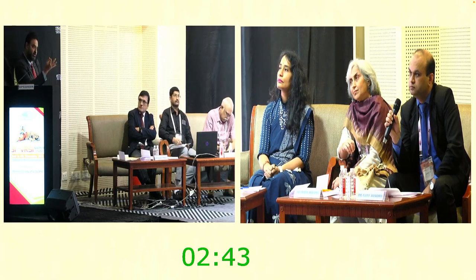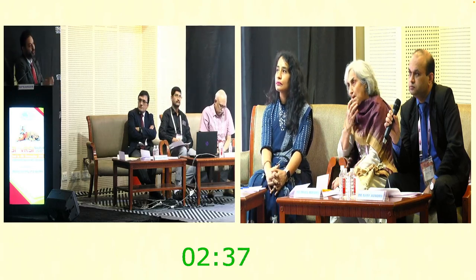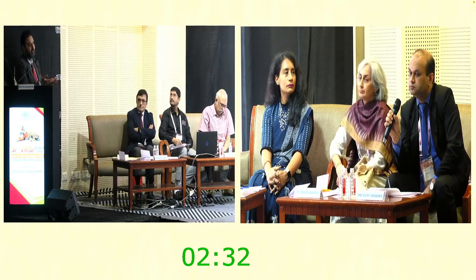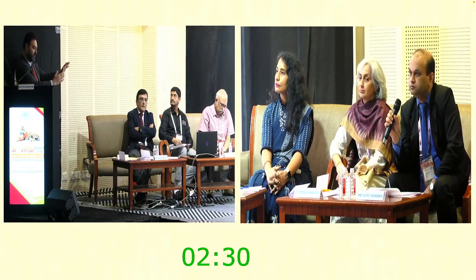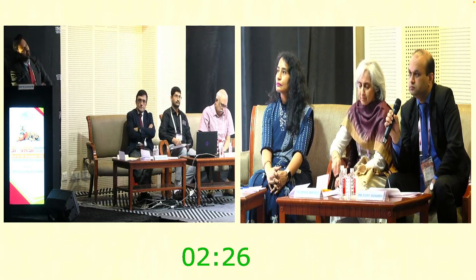So if we were to just use a 2cc syringe, 41 gauge cannula, poke it under the retina, and expect that all of that will come out, because the gauge is so small, the capillary action is very, very less. That's why we need a bigger gauge, because that's what's going to cause those cells to move up, anti-gravity, up into the syringe.